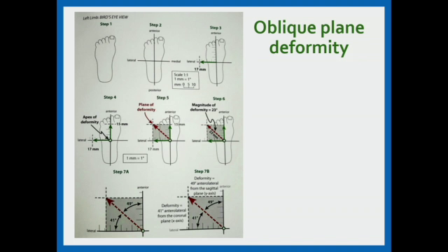So that 23 is the amount, or the degree, of deformity, and the plane you will get by calculating the angles. So in this particular example, you get a deformity which is 49 degrees anterolateral from the sagittal plane, or 41 degrees anterolateral from the coronal plane. So that's how you will place your hinge if you're doing a gradual correction with an Ilizarov. So you'll place it perpendicular to this particular line.